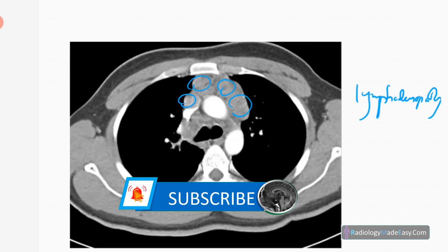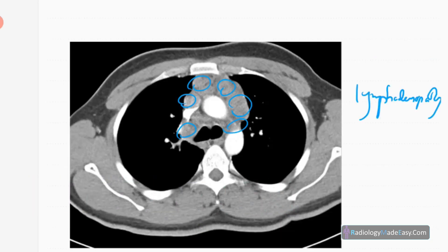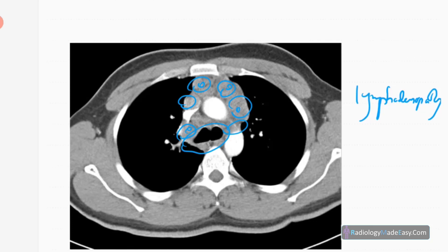On contrast CT chest, you can see multiple superior mediastinal and mediastinal lymph nodes at the level of the tracheal bifurcation — anterior and middle mediastinal hilar lymph nodes. Importantly, there are areas of low enhancement with necrotic centers, which is characteristic of TB lymphadenopathy. Sometimes they can calcify. The differential diagnosis includes lymphoma and sarcoidosis, but in those conditions you usually do not see necrotic nodes.